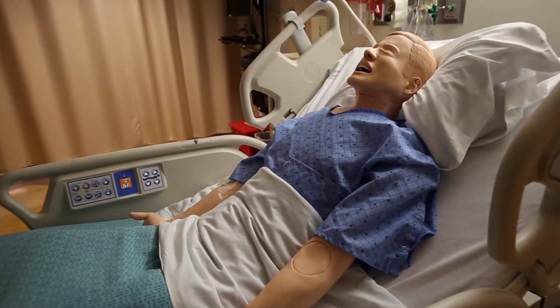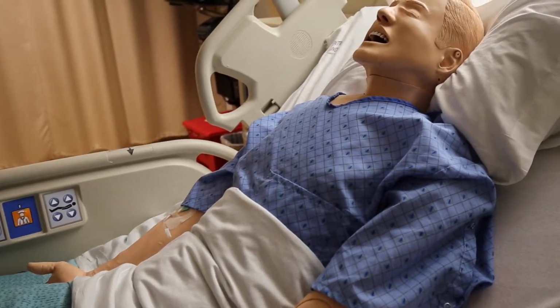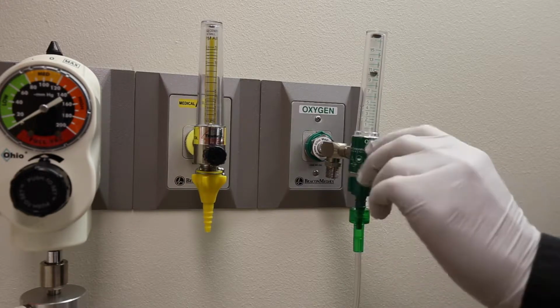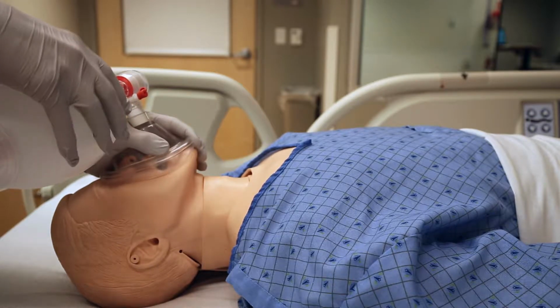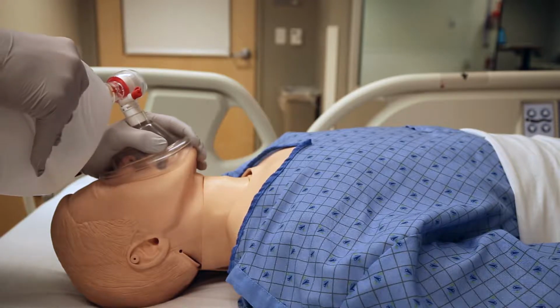Something you can see visually on the mannequin is spontaneous breathing. If you have the question whether your patient is breathing or breathing well, the mannequin does have chest rise and fall. That also includes when applying oxygen with a bag and mask or if the patient was intubated. Respiratory rate will also be shown on the patient monitor.